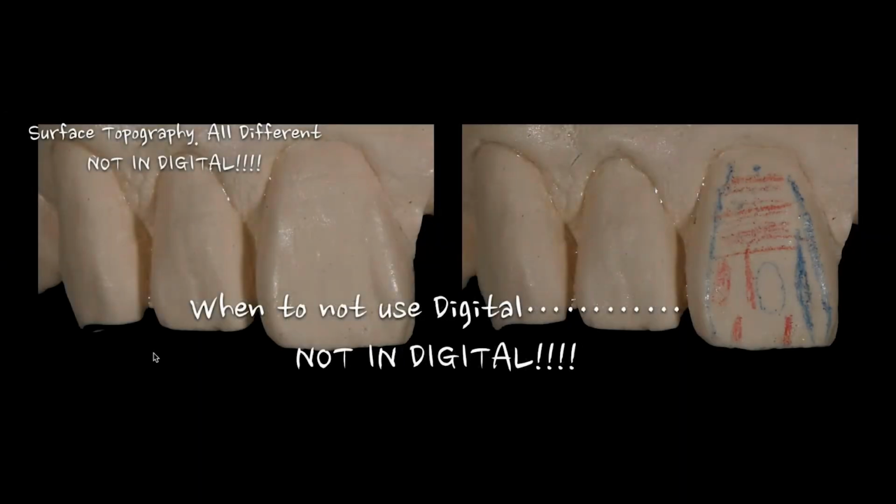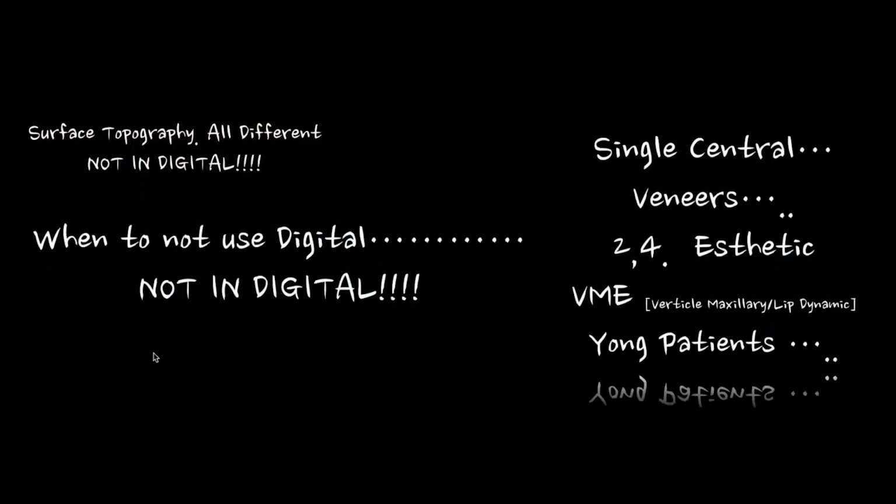And what do I mean by that? Perfect example. For me, I have a basic protocol in the lab that we try to follow. So one, a single central cannot be in a digital cast.